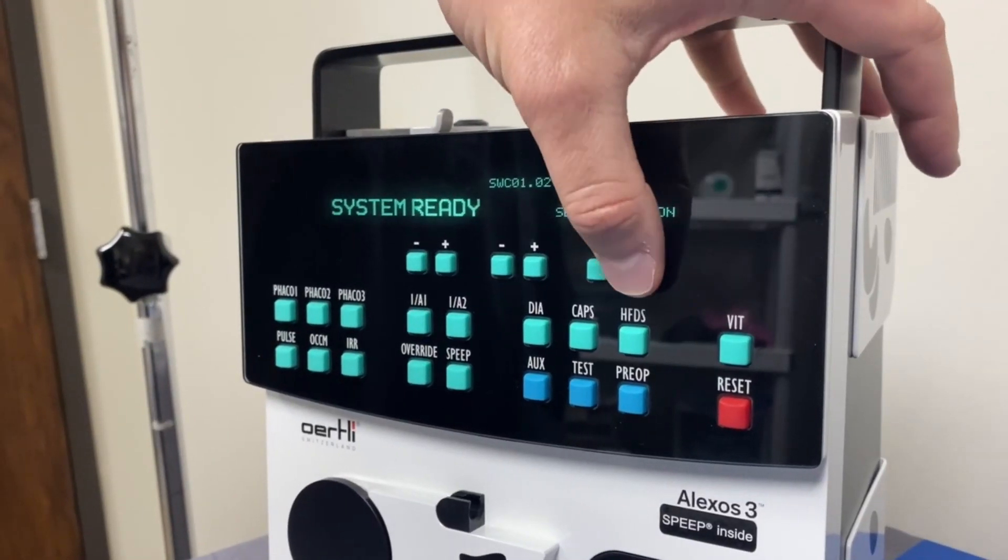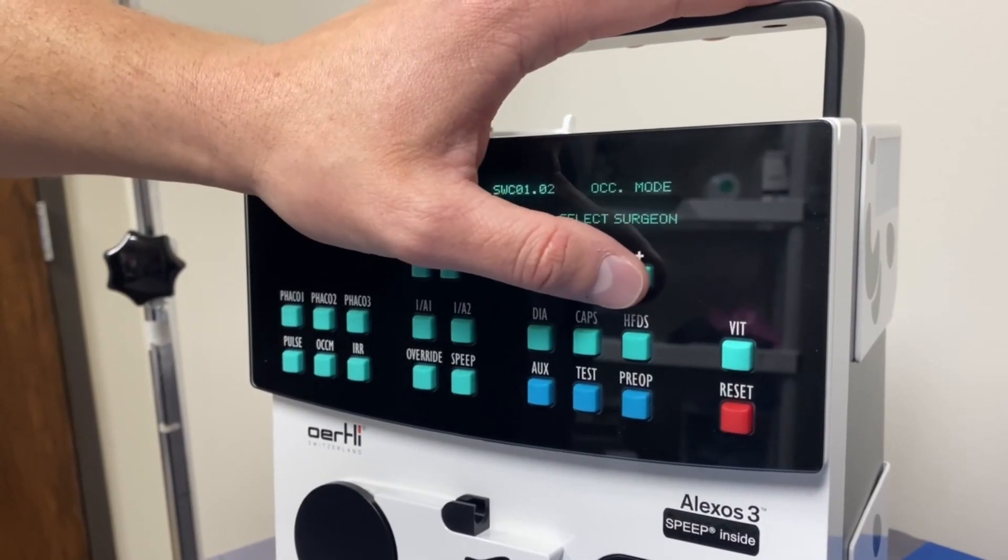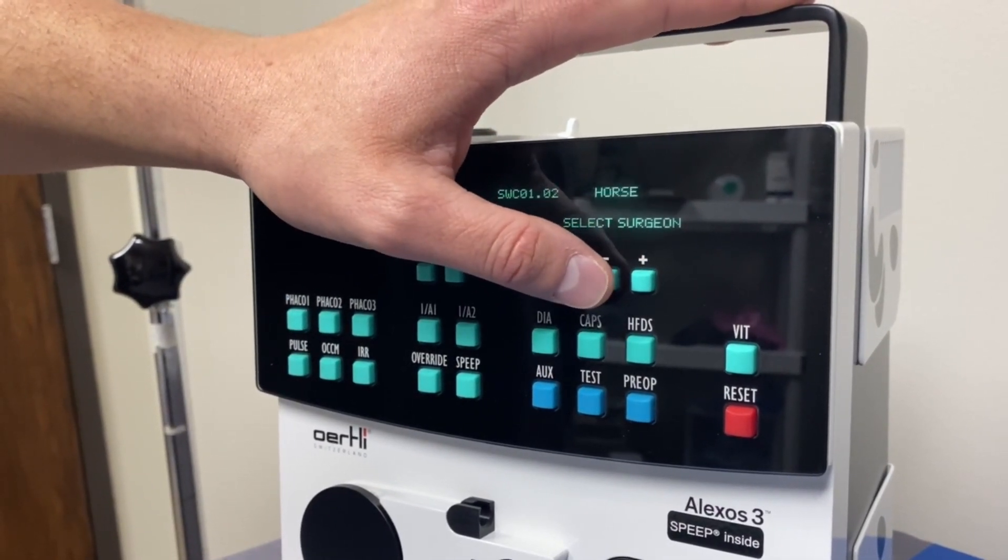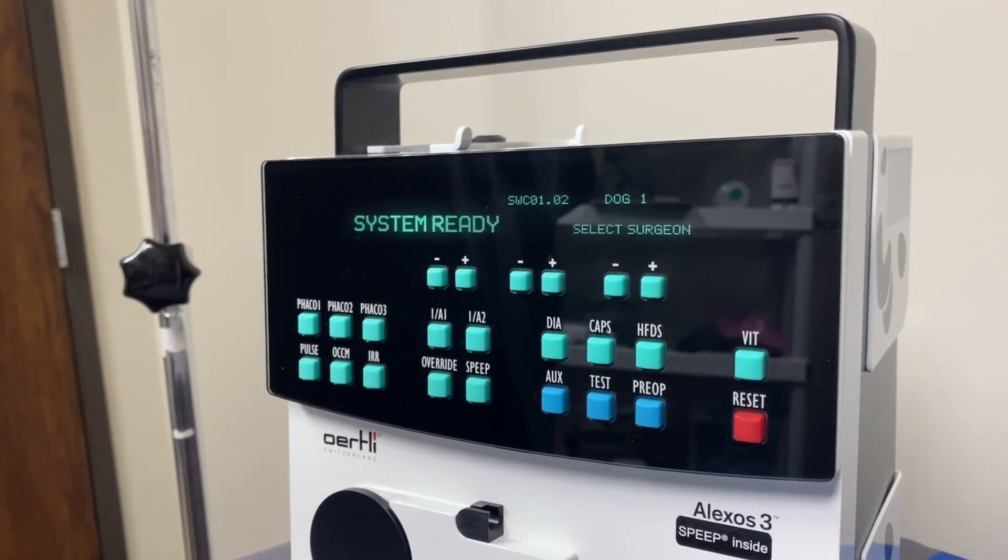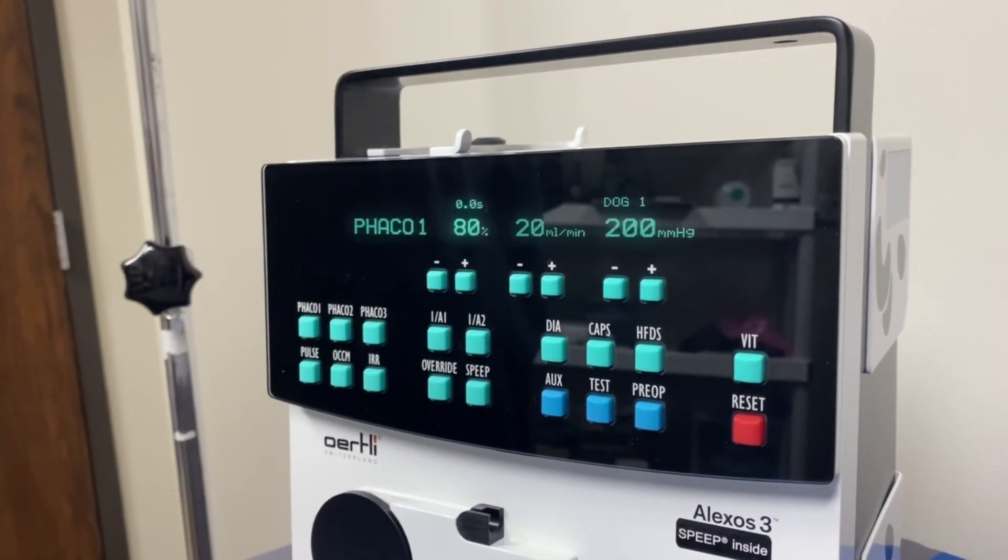From the startup screen, select the desired FACO program from the memory using the plus and minus keys on the upper right-hand side of the display panel. Select FACO using the function key on the display panel.